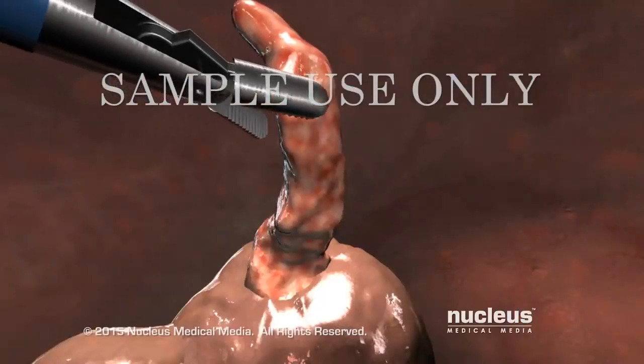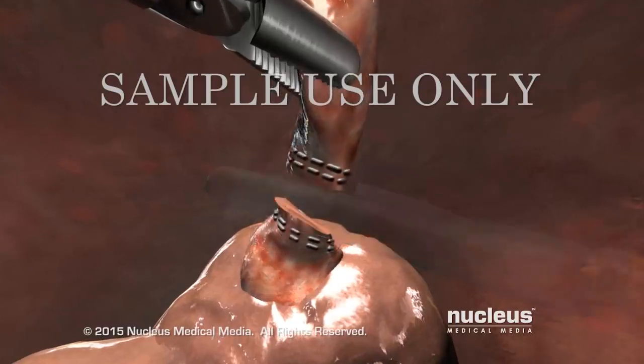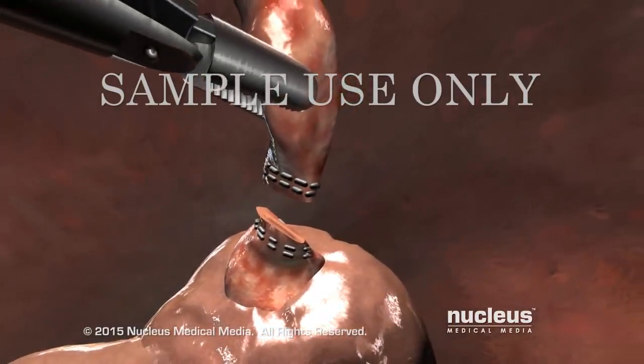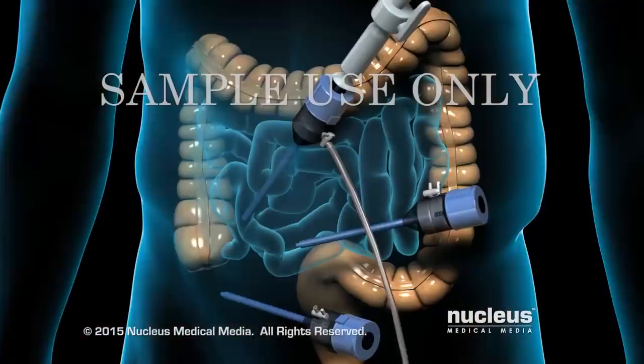Your surgeon will pass surgical instruments through these other ports to grasp the appendix. Another instrument will be used to separate the appendix from the intestine and close the ends with staples. The appendix will be placed into a specimen bag and removed through one of the ports.